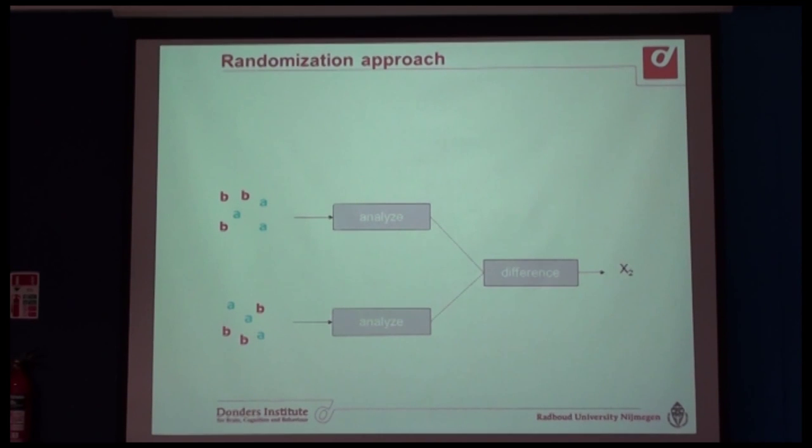So you can, for example, compute the difference as the difference between the mean divided by the standard deviation, but you could also just compute the difference in the means. You can compute a ratio, or anything like that.